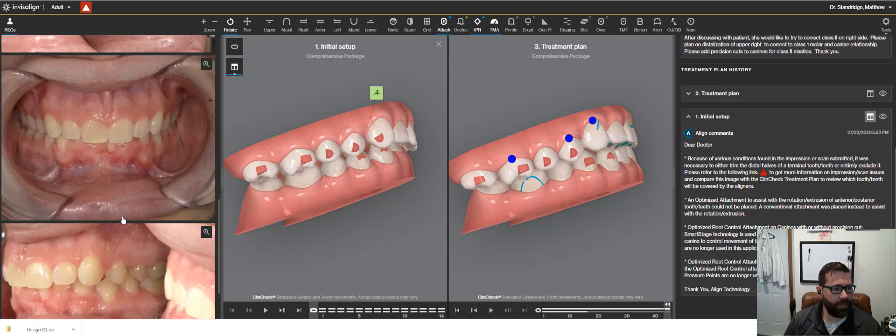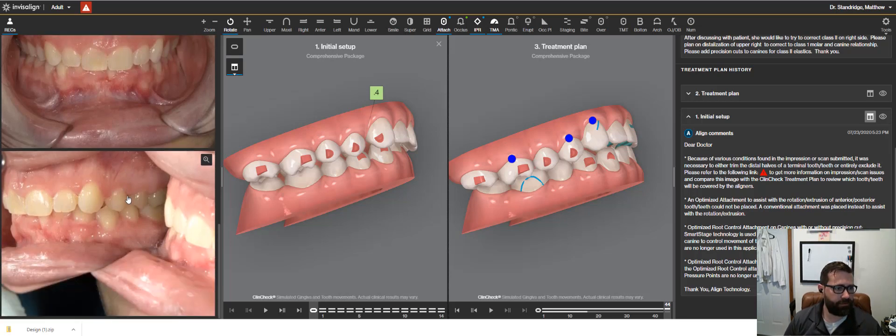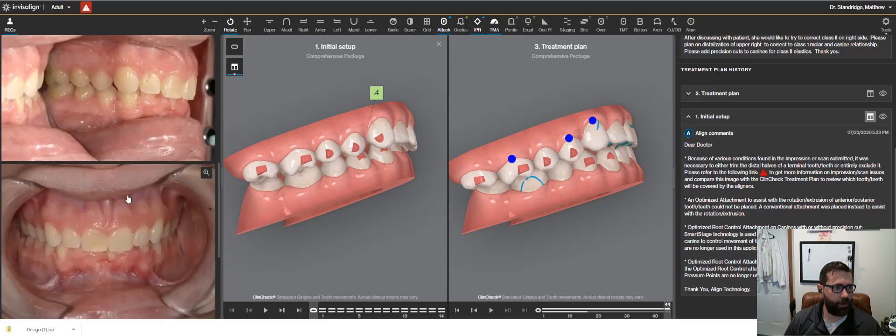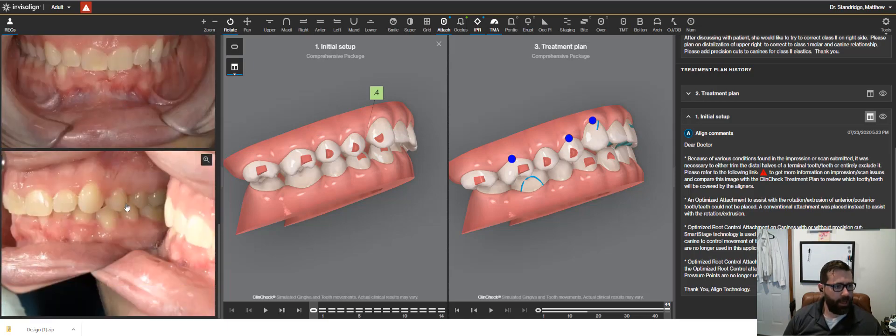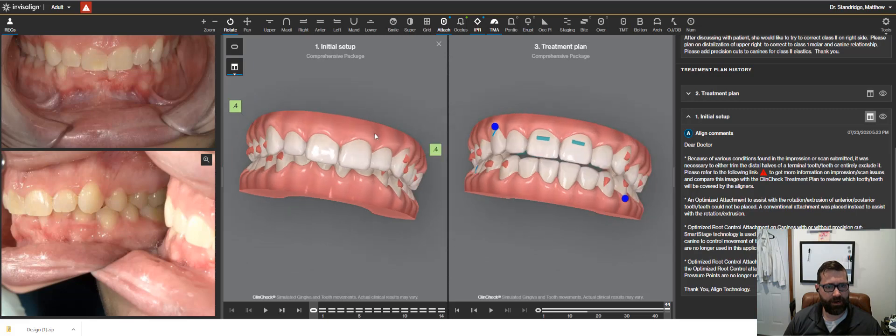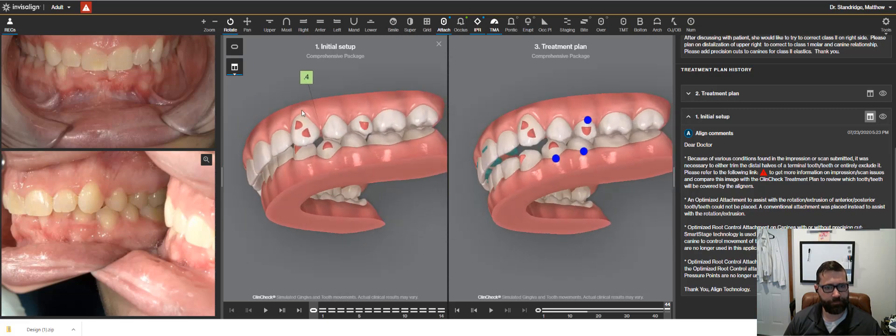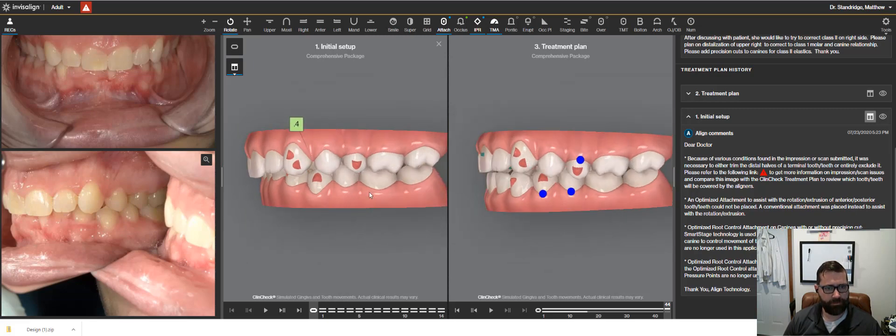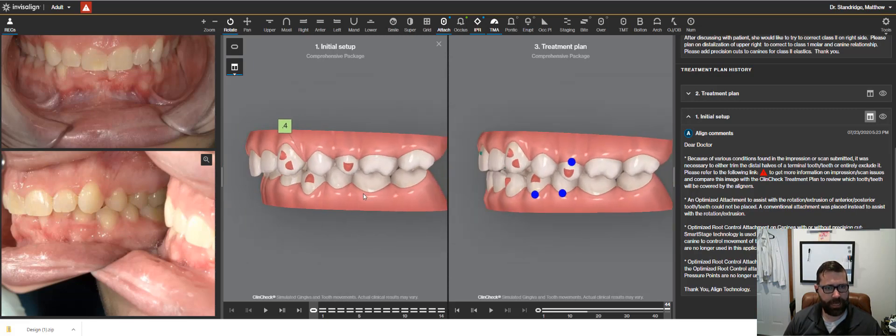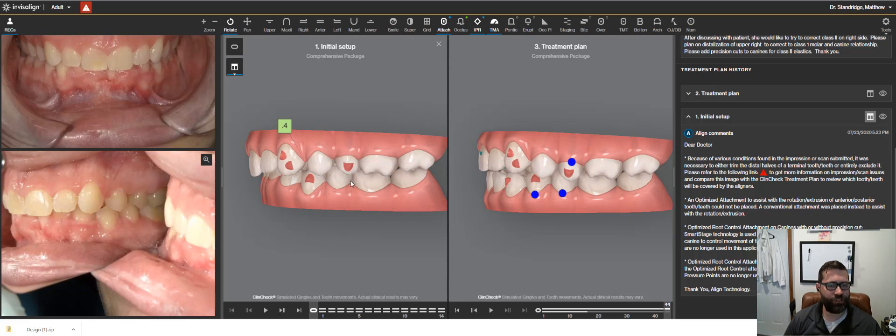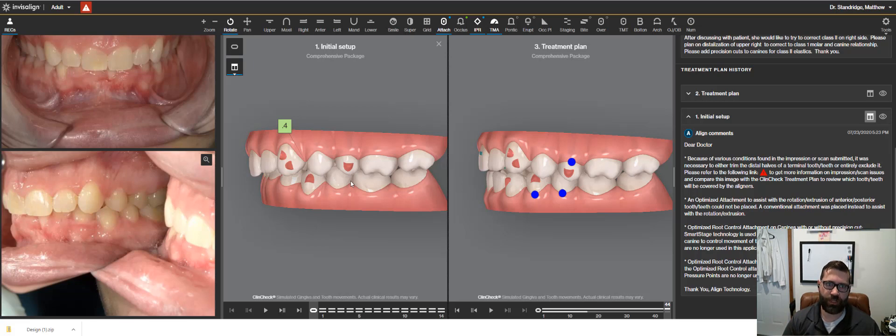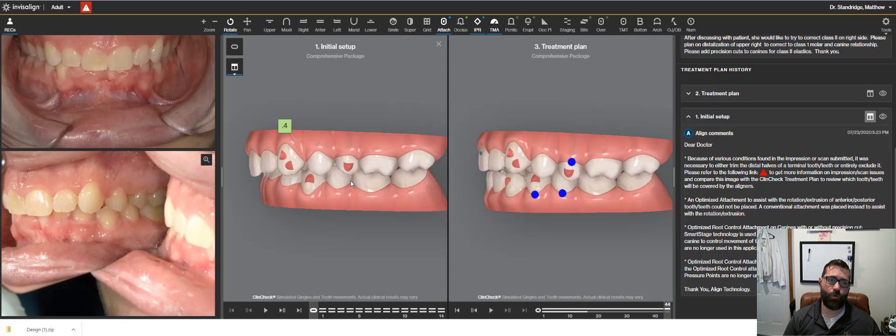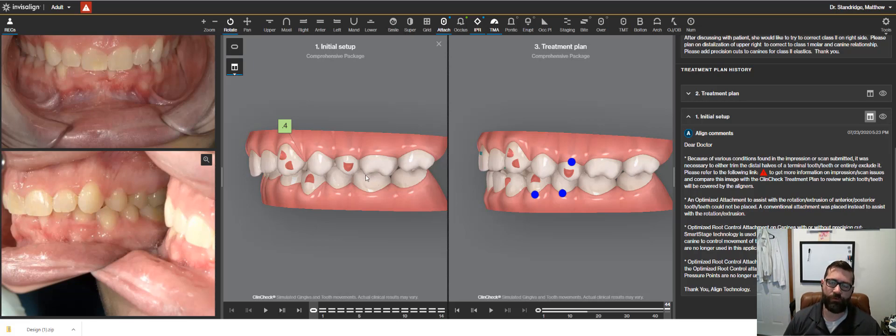And so if we look here, if I scroll down on our left side here, we're fairly class one, maybe just a hint class two. In my Ortho Foundations course, we talk about Andrew's Six Keys of Occlusion and really a class one, we're not just looking at where this mesial buccal cusp is, but where the central groove is.